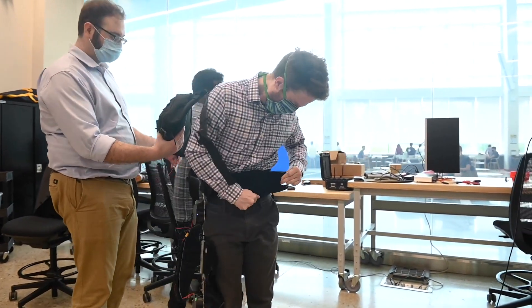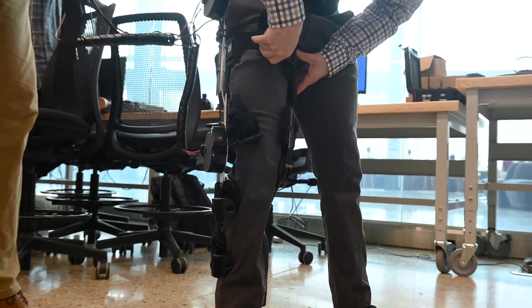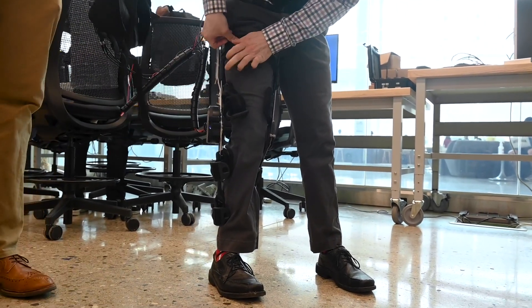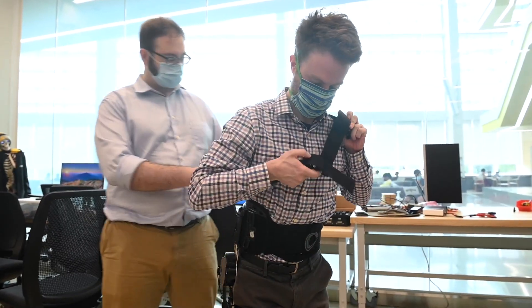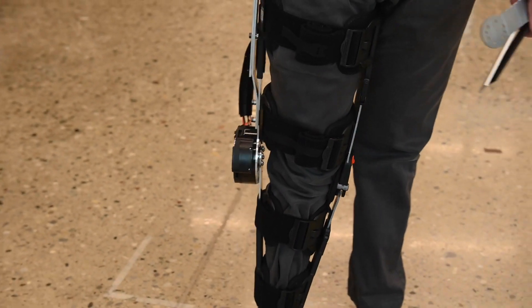That's very different from the standalone integrated full-body exoskeletons that people are used to seeing either in Hollywood or in the research community. This can be used as primary prevention of workplace injuries by preventing chronic overuse of the back, or it could be used to assist someone who has age-related frailty and weakness in their lower limb muscles.